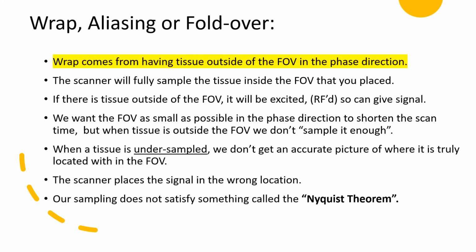Aliasing, wrap, or fold over. Don't know which term they're going to use. Unfortunately, you have to know all three of these. There's no way I remember what they used on mine, but I'm hearing that they use aliasing, but who knows? Know all three of these.